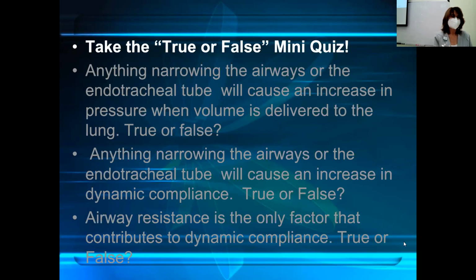All right, here's a mini quiz. The first statement, is this true or false? Anything narrowing the airways or the endotracheal tube will cause an increase in pressure when volume is delivered to the lung. True? Very good, it is true.